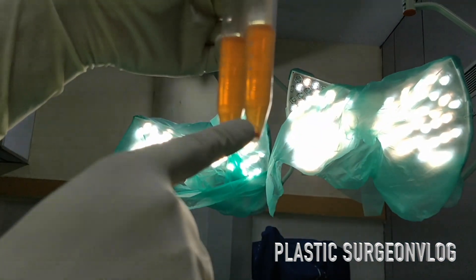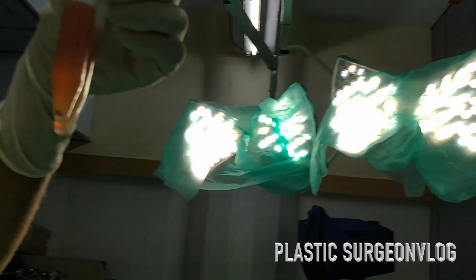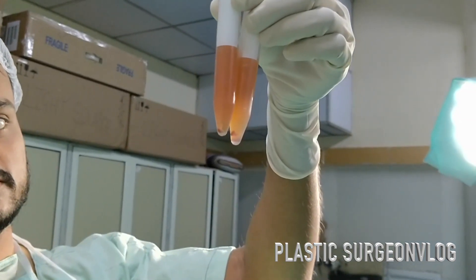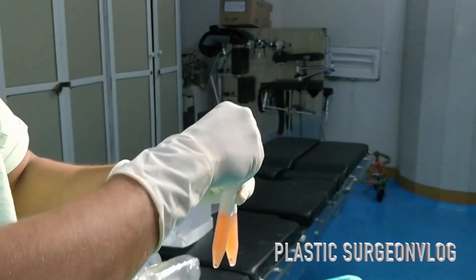After the hard spin, we have platelet pellets at the bottom of the test tube. In this zoomed-in picture you can easily see how these platelet pellets look — they are a white kind of structure.